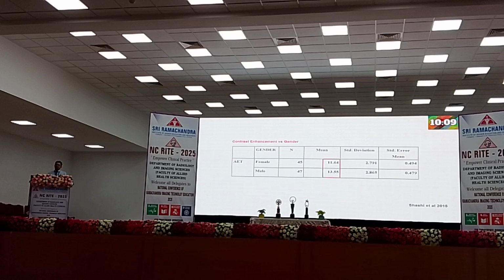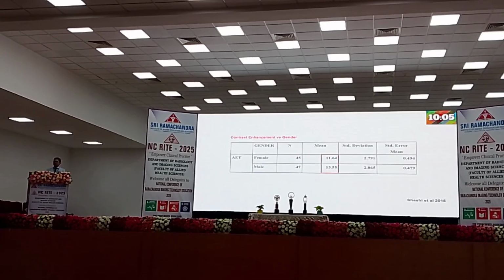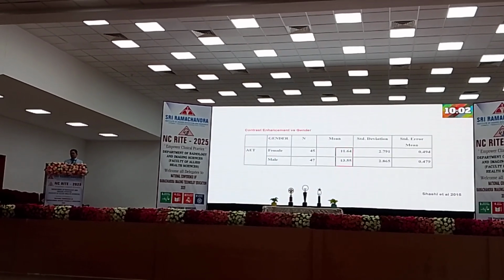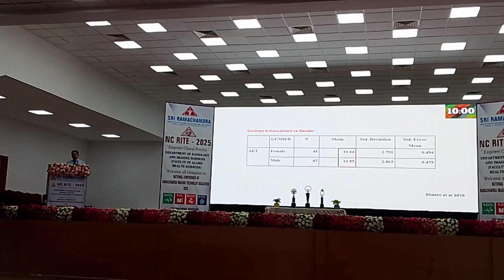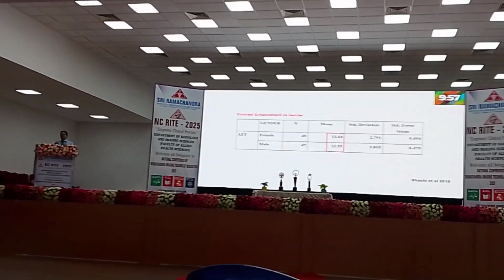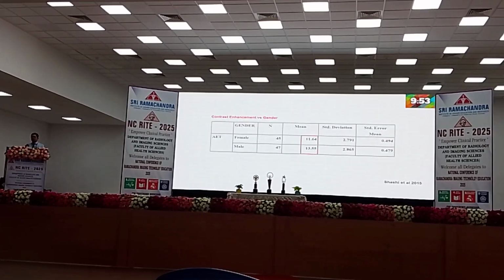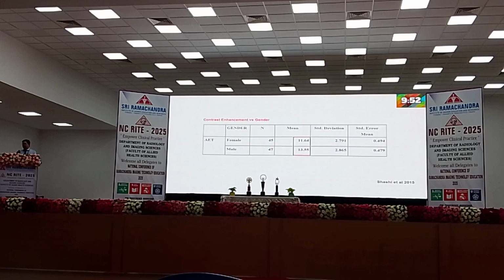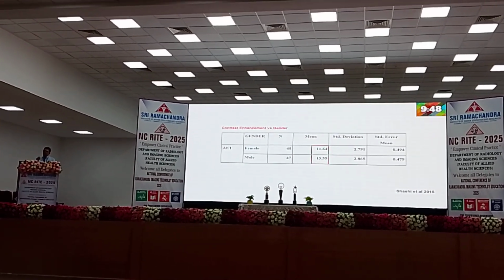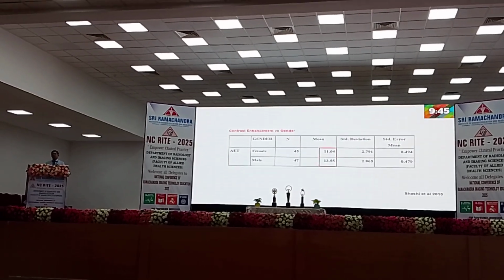It means, usually, the contrast reaching a particular area will take a longer time in a male patient compared to a female. So, whenever you are starting the scan, you should see the contrast reaching the particular area. For example, now you are doing an abdomen scan, where you will place the locator at the level of D12 L1, or in some places between D11 and D12, right? So for the female and the male, the contrast reaching that particular area will vary, especially for the male, it will take a longer time.